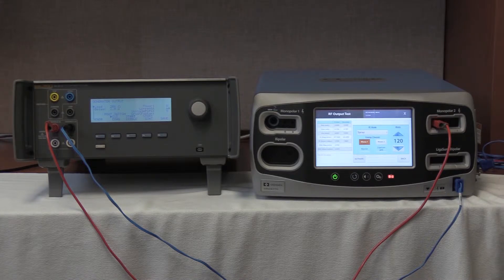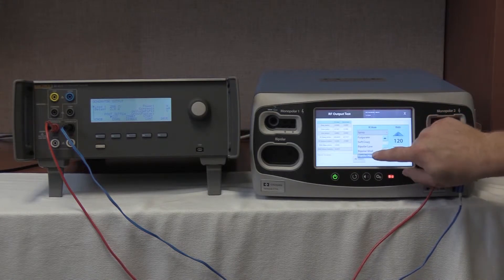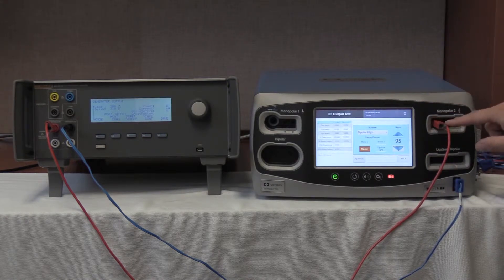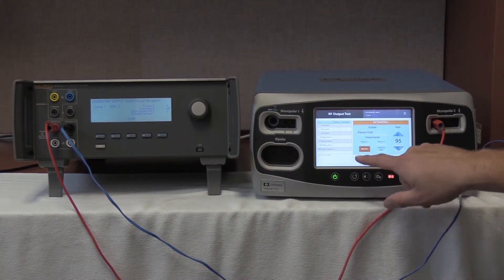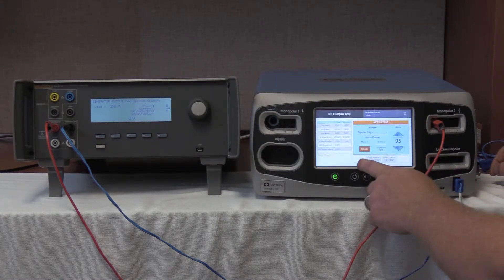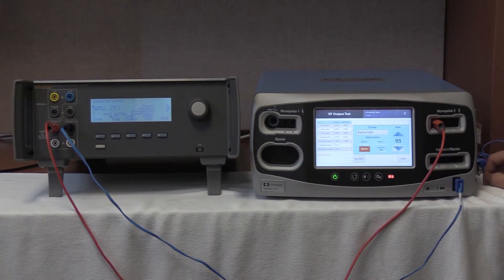We are now going to select bipolar high. RF mode, bipolar high, 95 watts, push up arrow. We are going to still be connected to the monopolar 2 port, activating the monopolar 1 port. 95 watts. Start continuous. Activating the FT10. There is no reading, so that means we have no amperage coming across. Bipolar — deactivate, no hold, stop on the QA-ES III.